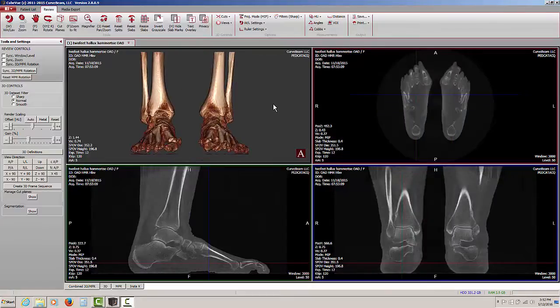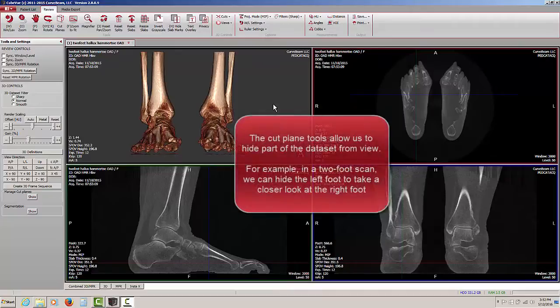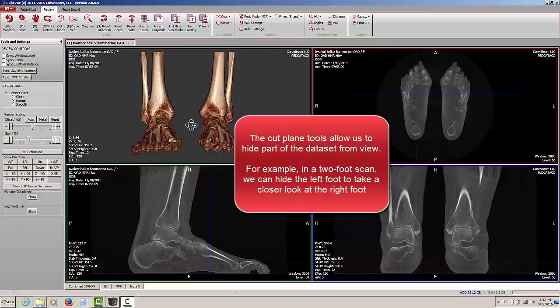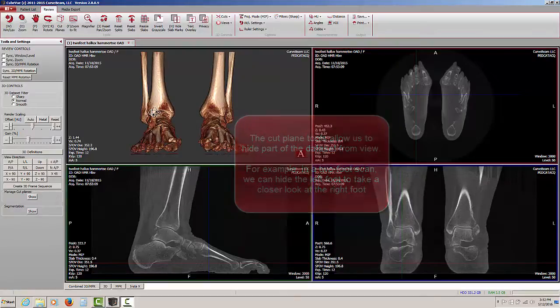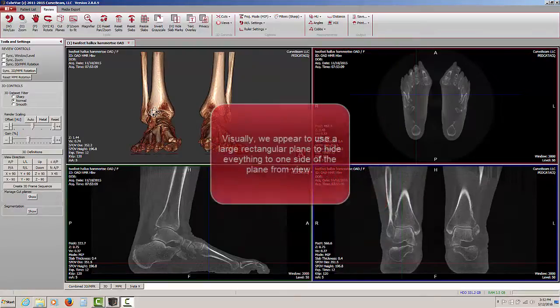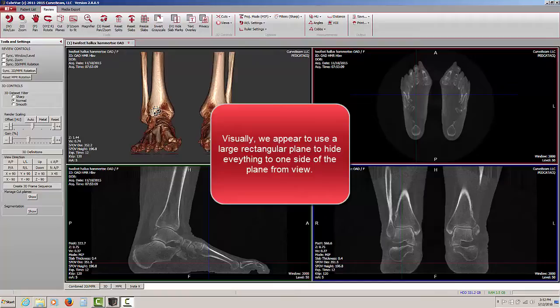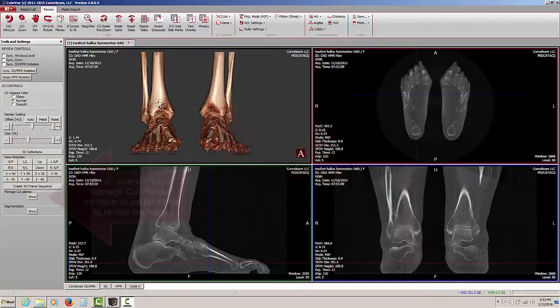Using a different data set, let's take a look at the cut plane tools. The cut plane tools will allow us to isolate part of the patient data set that we see here, for example to just look at the left foot or the right foot by essentially sliding a large flat plane between the two, which we can also change the direction of, and removing part of that from the 3D rendering.